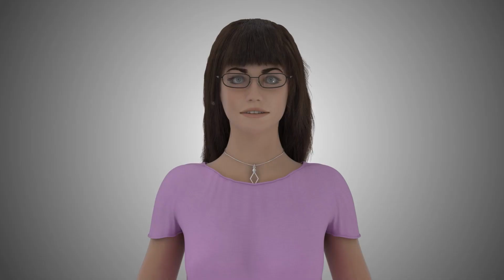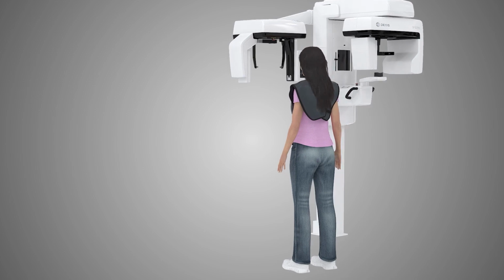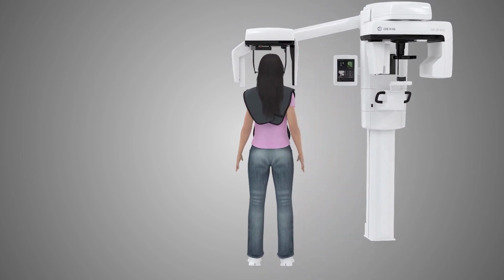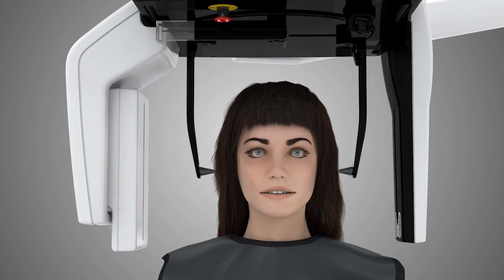Ask the patient to remove any metal artifacts, including glasses, earrings, necklaces, hairpins, or other removable appliances from the shoulders and above. Properly place a protective lead apron over the patient in accordance with local safety regulations and guidelines. Ask the patient to stand as straight and tall as possible in front of the cephalostat head. Adjust the unit height so it is slightly higher than the top of the patient's head using the up-down arrows on the positioning panel.